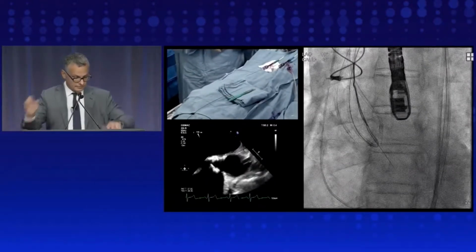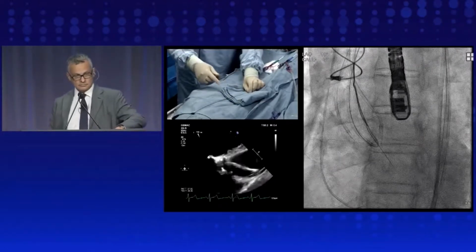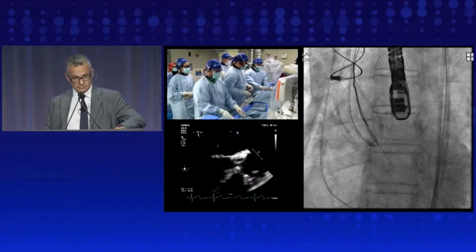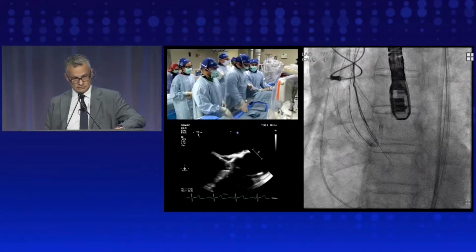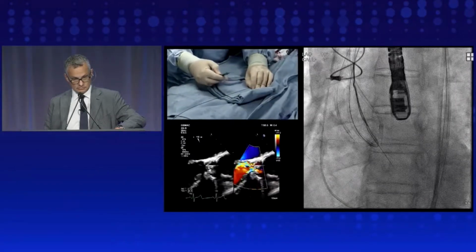And the rationale for that was just from a safety standpoint. Now, she has very significant AI, so she should tolerate it, but obviously we're being careful. Danny's going to show the technique of denuding the wire.